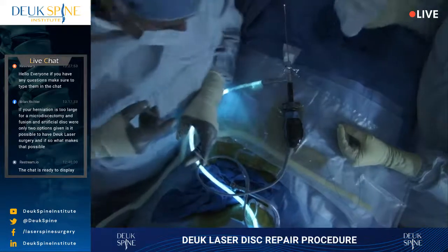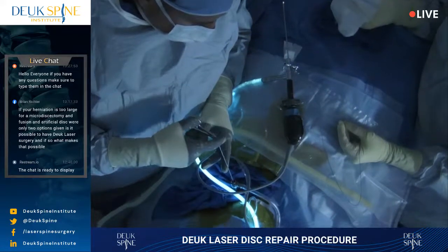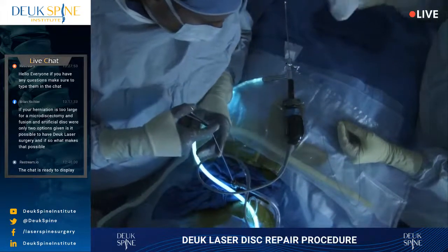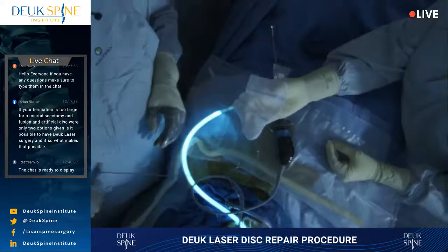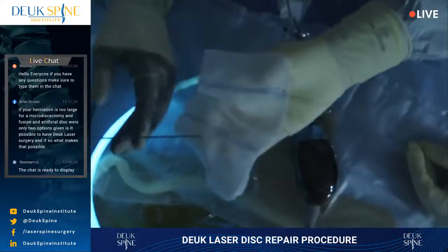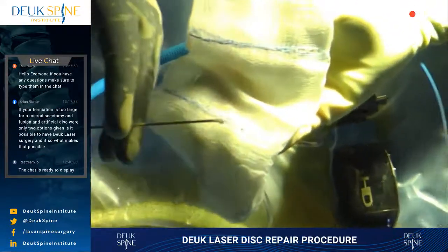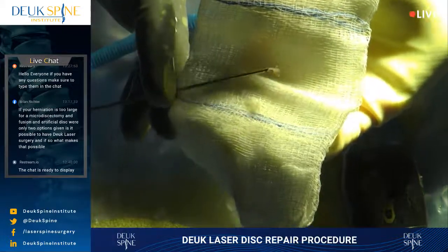It's so big it doesn't want to come out. There it is. Okay, take a look at this. Turn the light on. All right, this is just one piece of the herniation, but it's a good size one. Can you guys see this, Diego? Right there? Yeah, we see it.